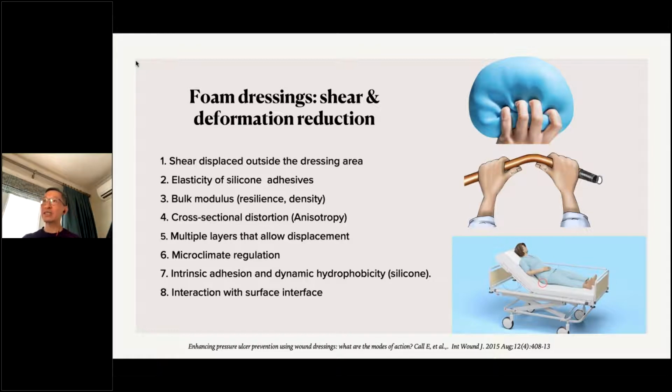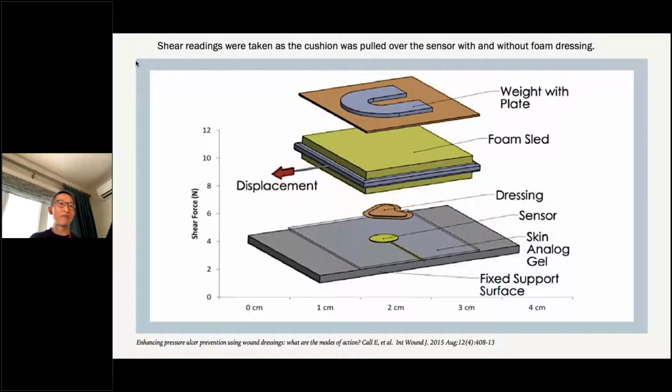It usually is a semi-permeable membrane, allowing vaporization, allowing the moisture to be lost into the environment. In that way, you can regulate the microclimate, regulate the moisture level in between the dressing interface and also the skin. So, I think you can see the different mechanisms involved.